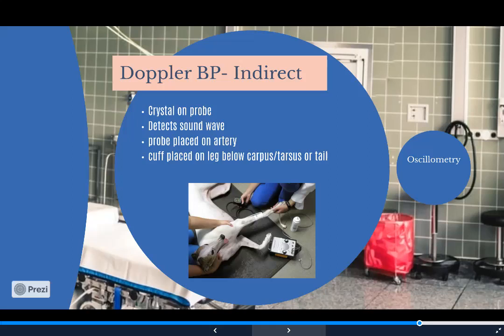The idea behind it is so that the blood pressure is taken the next time exactly the same way, so you can do this on a trend, right? We don't want to change anything up. So we know exactly how we can repeat it and we can notice that trend over time. Because if we change anything, there's a lot of variables.